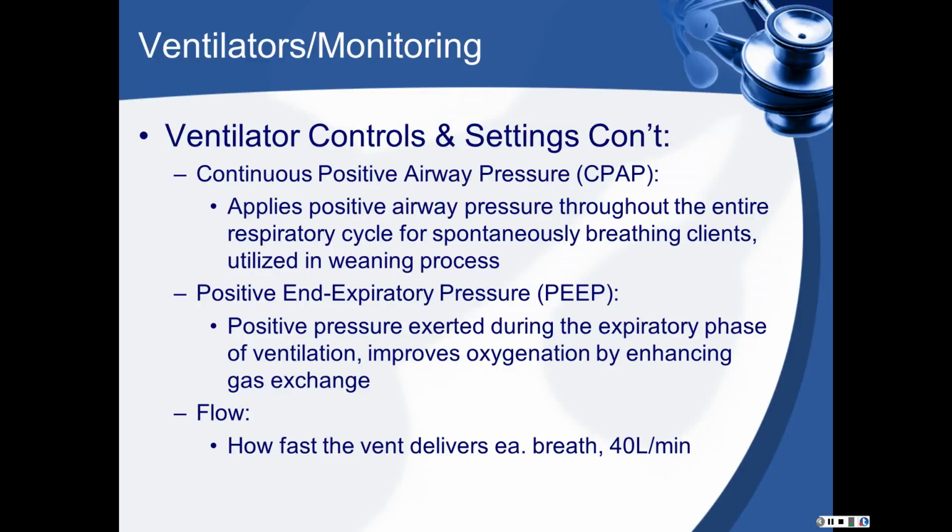PEEP should be increased in arterial blood oxygenation so that the FiO2 can be decreased. Remember, we don't want to leave that FiO2 very high for very long. The amount of PEEP is usually 5 to 15 centimeters of water.